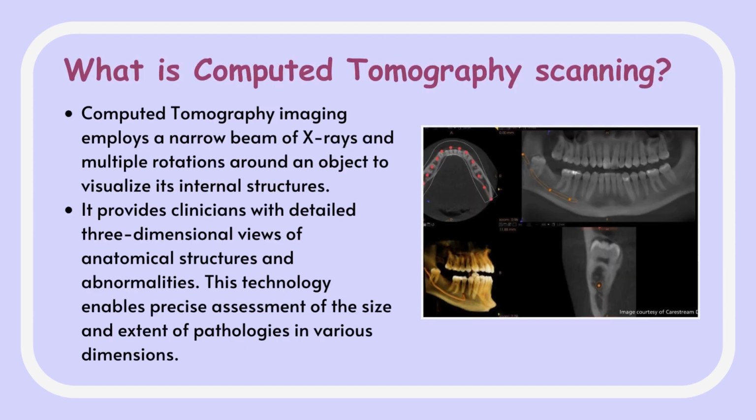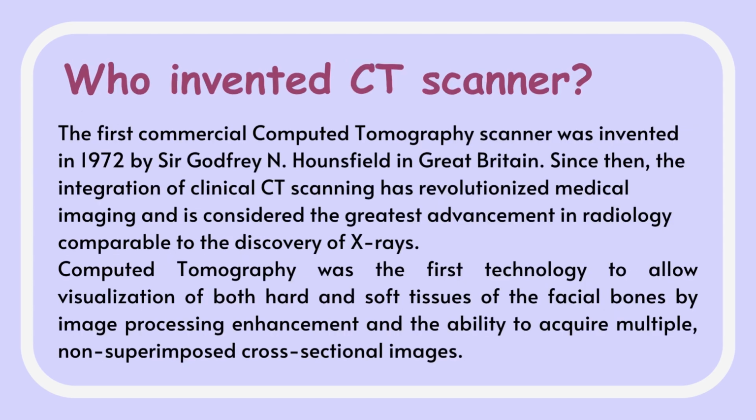What is computed tomography scanning? Computed tomography imaging employs a narrow beam of X-rays and multiple rotations around an object to visualize its internal structures. It provides clinicians with detailed three-dimensional views of anatomical structures and abnormalities. This technology enables precise assessment of the size and extent of pathologies in various dimensions.